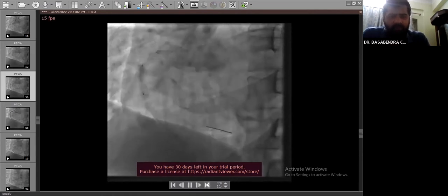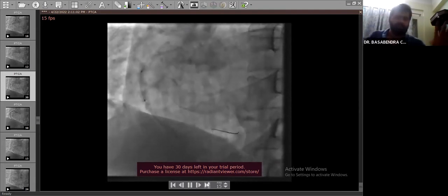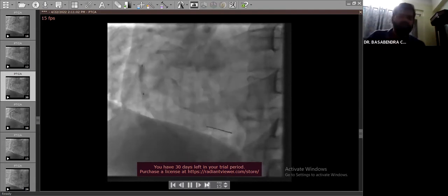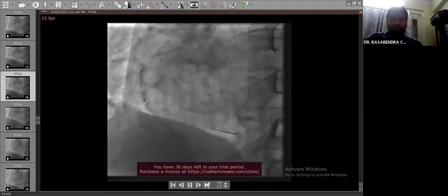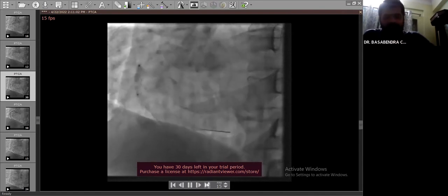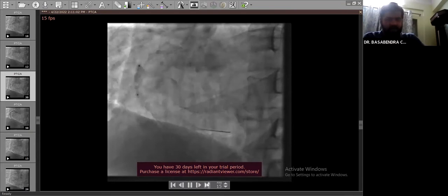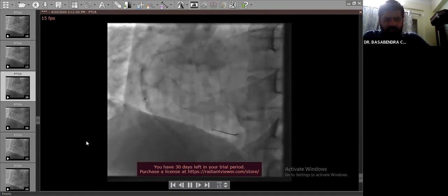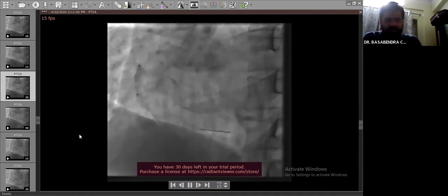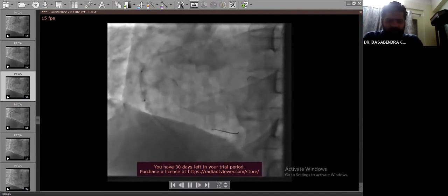After that, just to test whether we could take a stent of a fair size, because it was a long lesion and we had to take 2 stents, both of which had to be quite long, we took a 2.5x20 semi-compliant balloon, and it could be taken down. There was not much of a problem in taking the balloon down to the distal RCA, and we also gave a high pressure dilatation at the distal and mid parts.